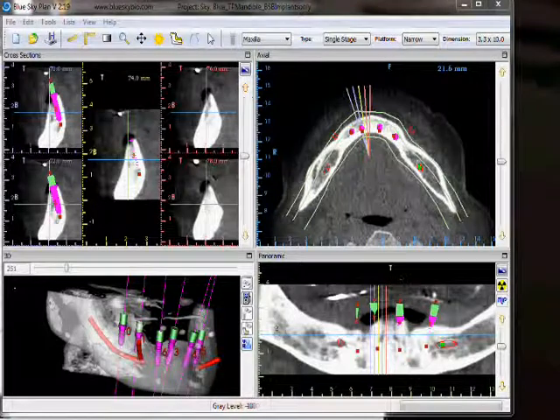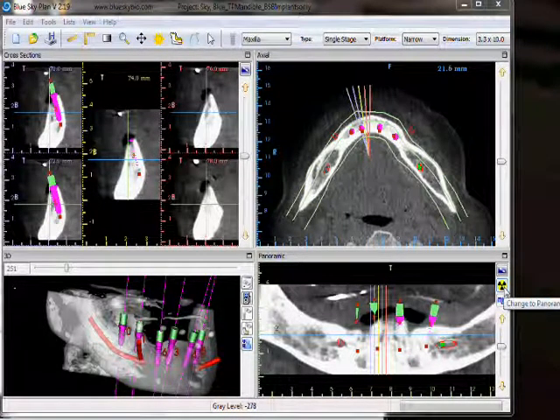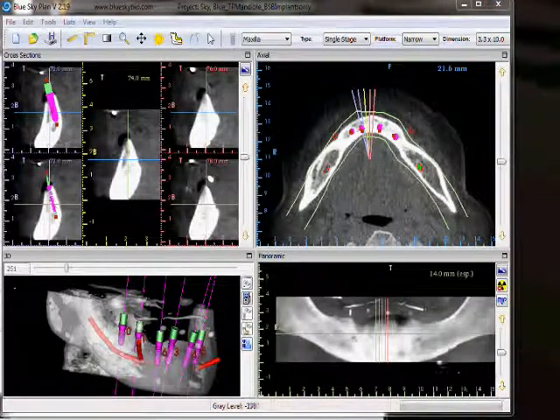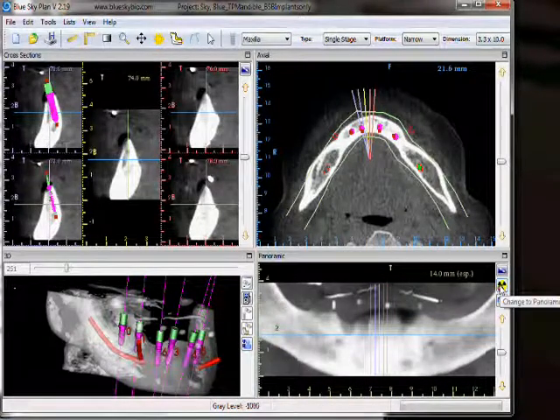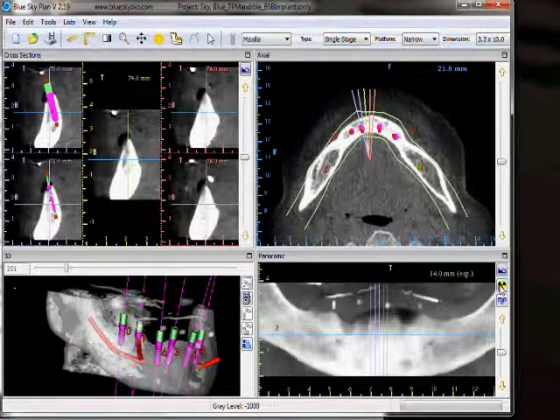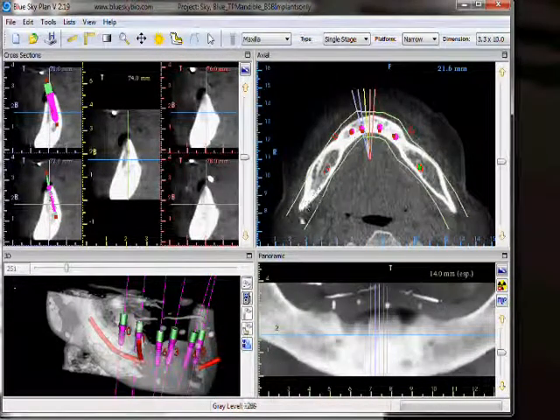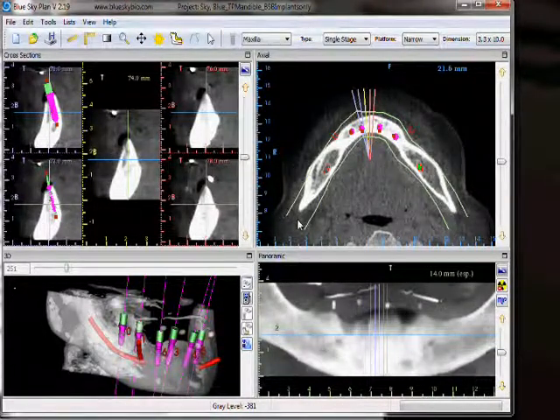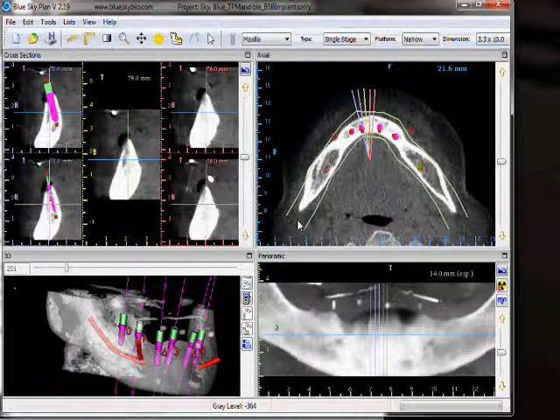Clicking on the second icon from the top on the right side, we are able to change to a panoramic composite view, which often represents how an x-ray will look. Some doctors find this useful to toggle back and forth between a composite image and an individual slice image. Note that our middle panoramic curve has disappeared because we are no longer looking at one slice — we are now looking at a composite view of all the slices together.